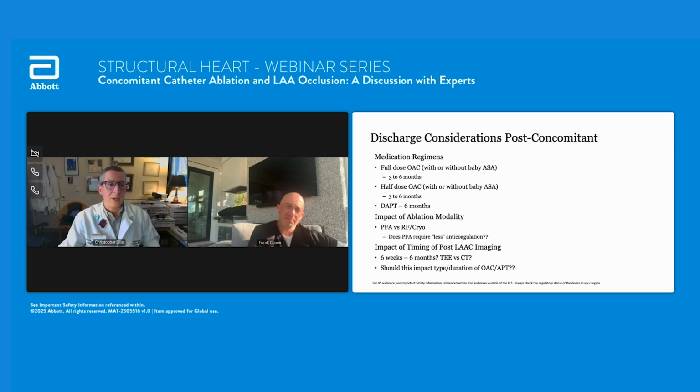So those patients, if I'm doing a concomitant with Watchman, I pretty much just leave them on full dose DOAC for 90 days and then image. But to be determined, as you said, there's a lot of moving parts on this.